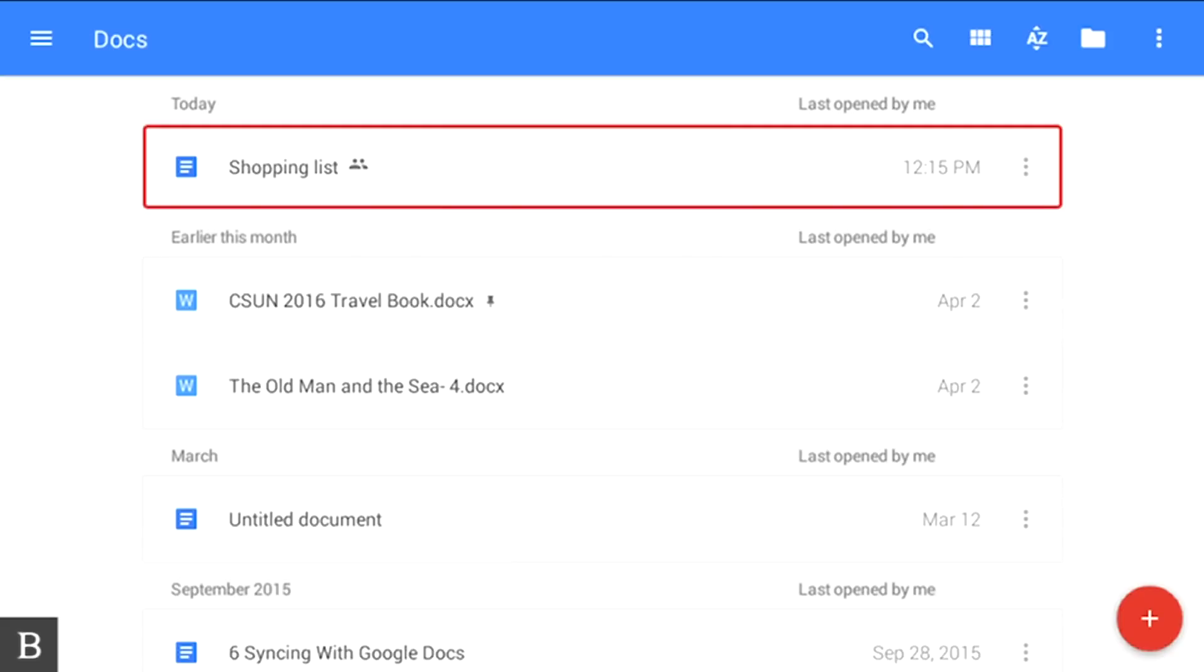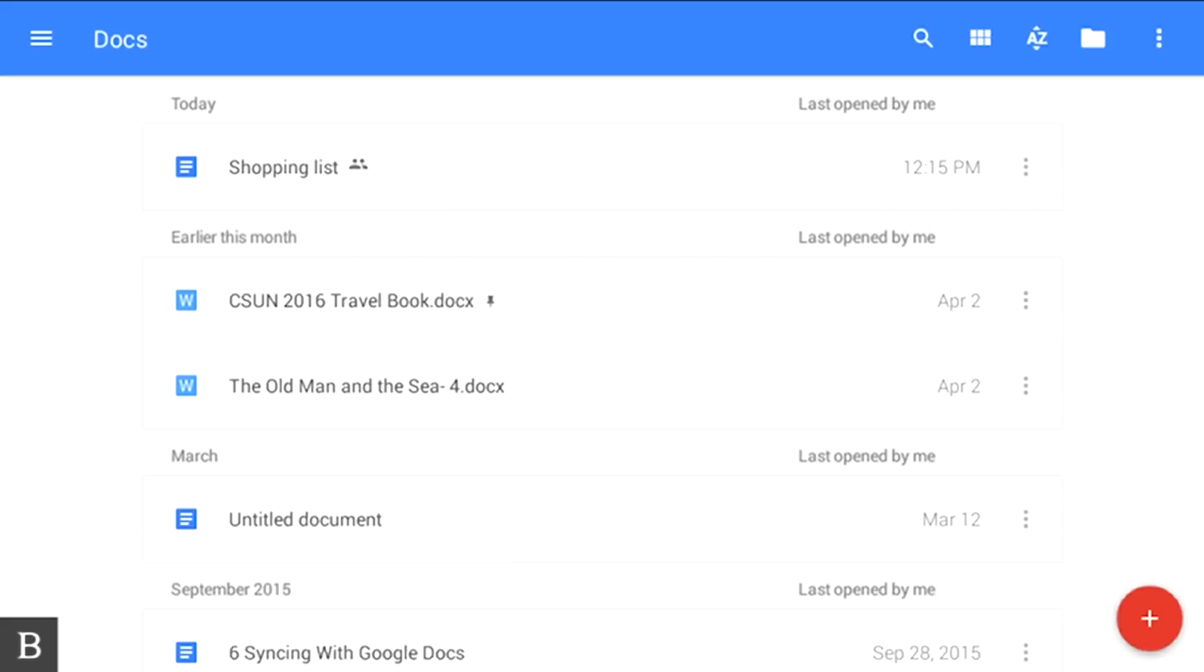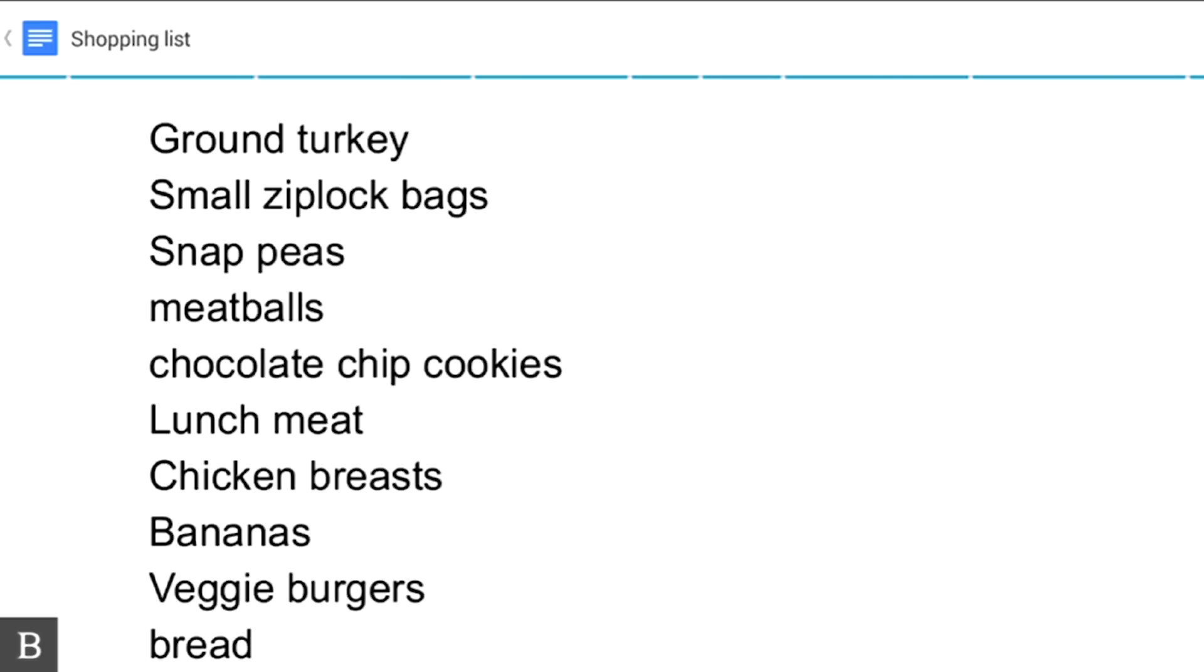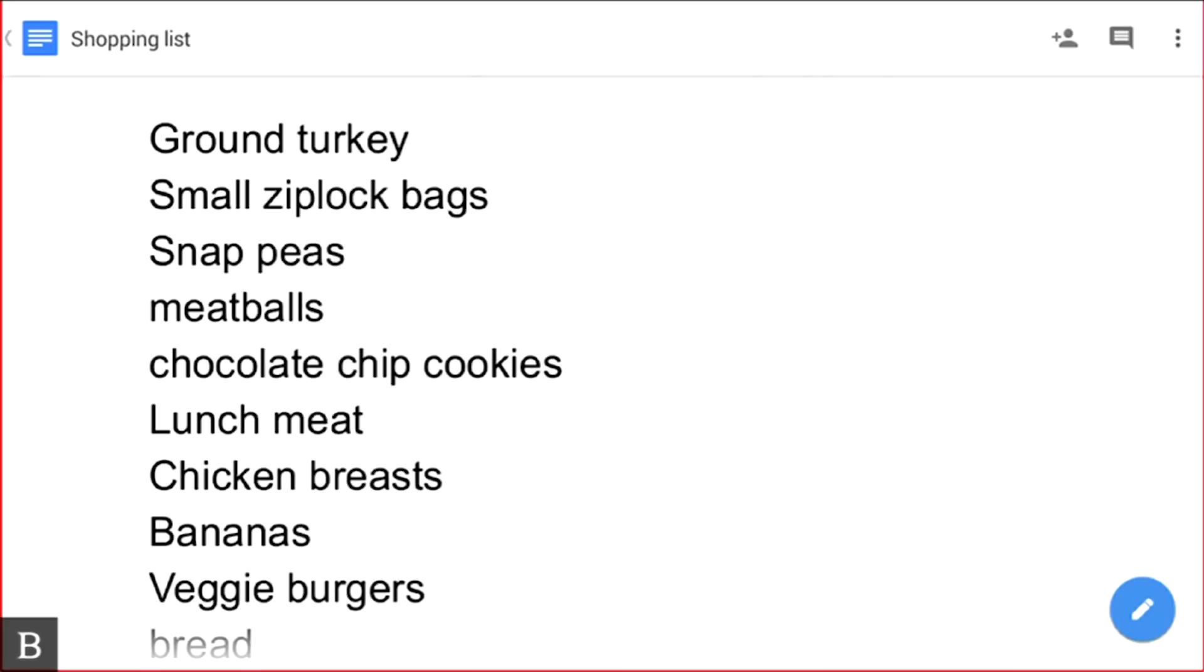I'm going to activate it by pressing my cursor router key. It's opening the Google Doc from the cloud. I'm in my shopping list Google Doc now.